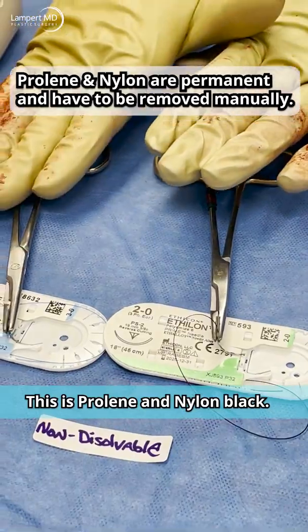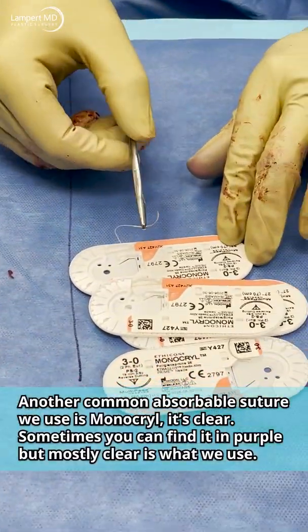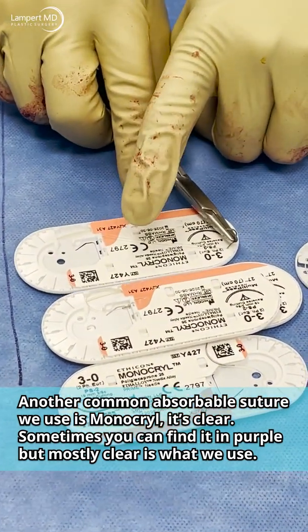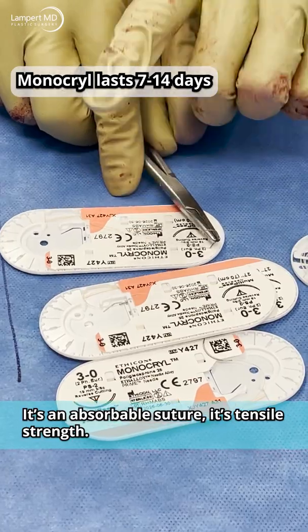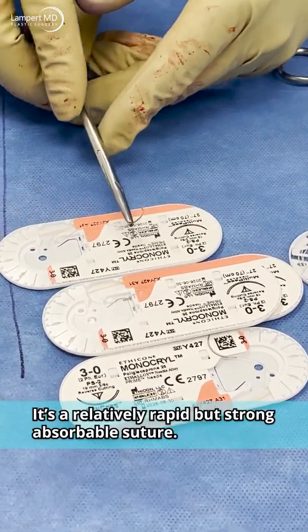Another common absorbable suture we use is Monocryl. It's clear — sometimes you can find it in purple, but mostly we use clear. It's an absorbable suture; tensile strength lasts about 10 days. It's a relatively rapid but strong absorbable suture.